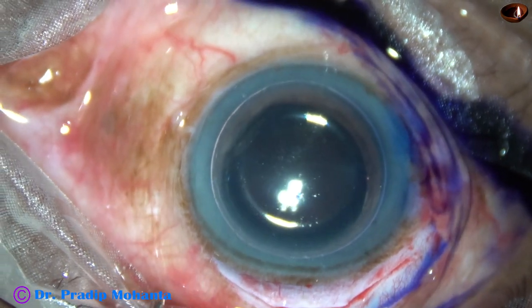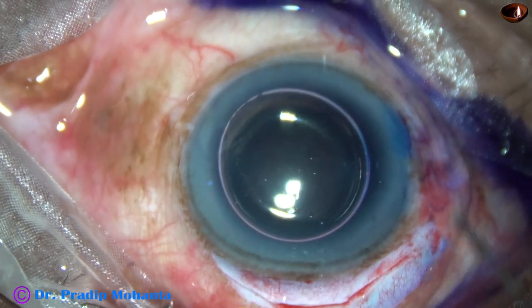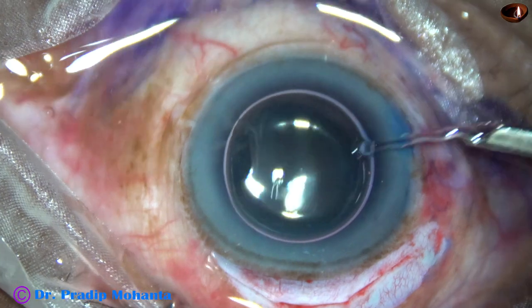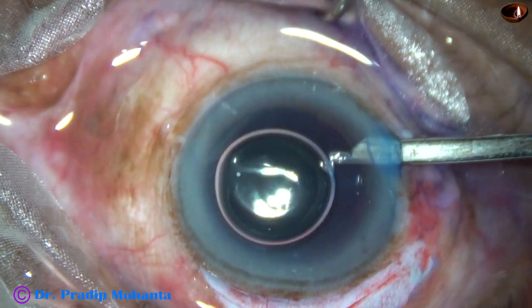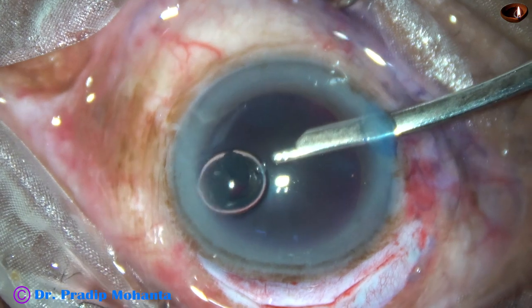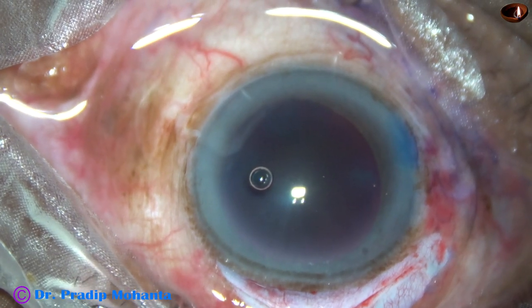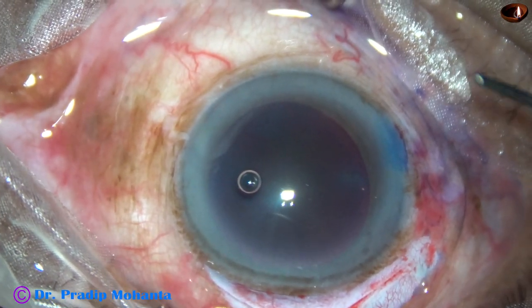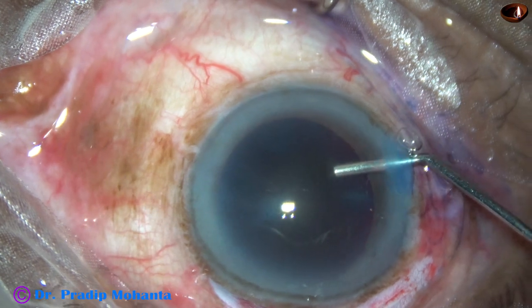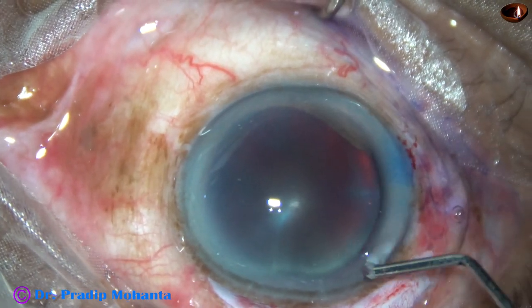The main sclerocorneal tunnel has not been opened. The sclerocorneal tunnel is not self-sealing, we know that, so I am going to put sutures to close it. The dye is washed out with BSS. And now the anterior chamber is filled up with 2% HPMC — hydroxypropyl methyl cellulose — 2%. HPMC is applied over the cornea also for better visibility.